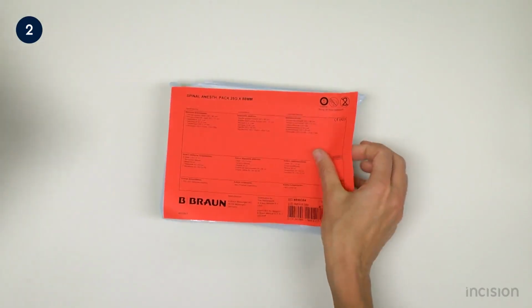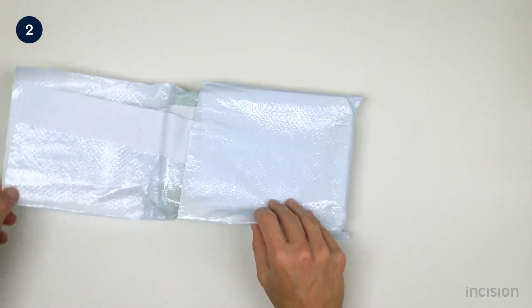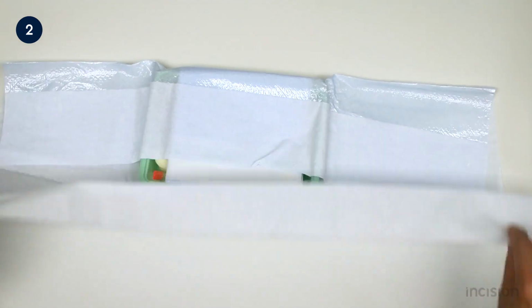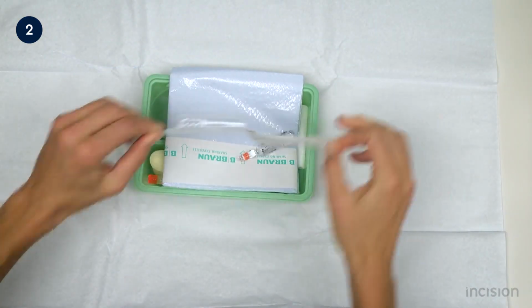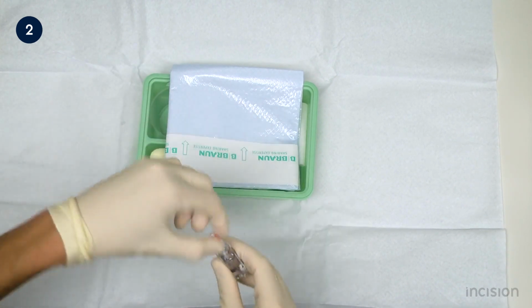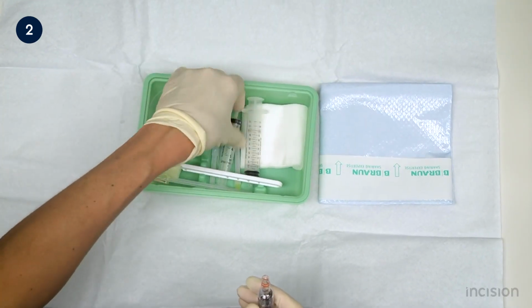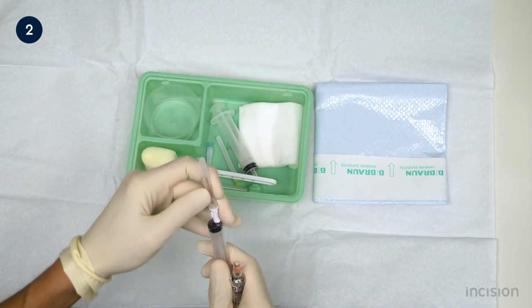Spinal anesthesia should be administered aseptically, and in some centres, the required implements, including the spinal needle, are pre-packaged in a sterile pack like this one. Given differences between hospitals, attention will not be given to how the pack is set up, but rather to what should be available when administering spinal anesthesia. As previously mentioned, this is an aseptic procedure. Local protocol for hand hygiene and aseptic technique should be followed.